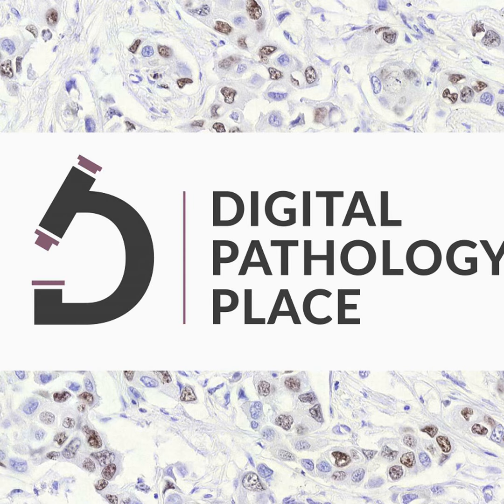This is known as the digitization step. It is being done with scanning devices called whole slide scanners. Digital pathology uses a whole slide scanner to capture the whole slide image, which involves taking multiple pictures at various magnifications to create a zoomable dynamic image that mimics viewers' experience with a microscope, but on a computer screen. The scanner components include 1.